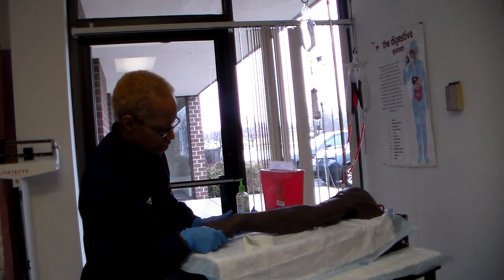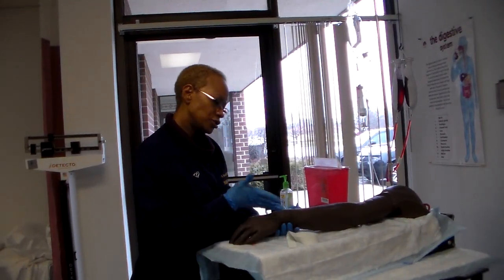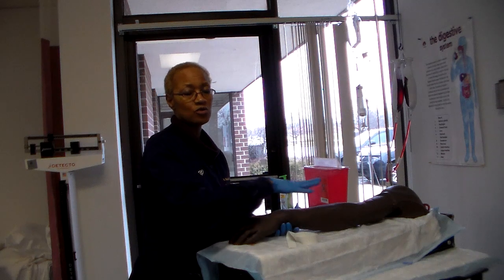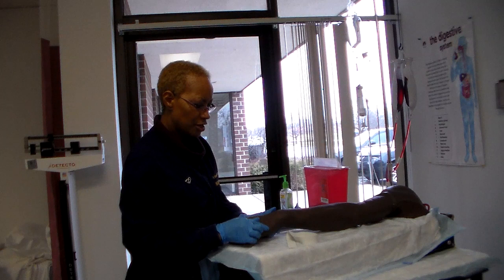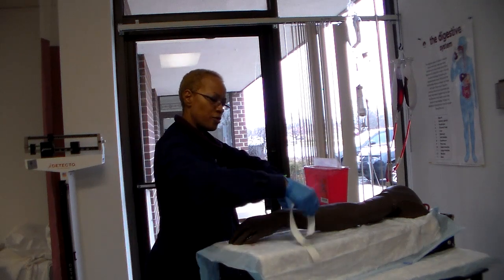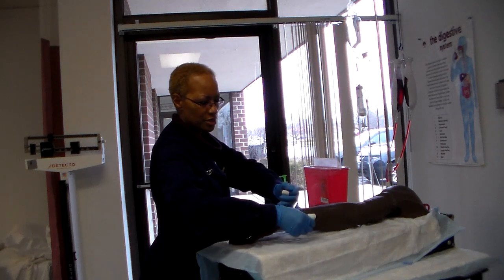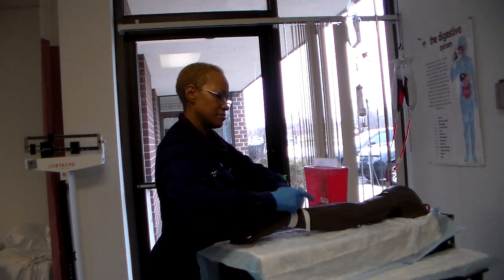So I'm going to look at the veins that my client has, and you want to start more distally. So we're going to start distal and work up. Hopefully you'll get in first time and you won't have to worry about his forearm or anything like that. But we're going to start in his hands, and we're going to look at the IV sites that we have. So about 4 to 6 inches above the site. So I'm going to start here. You're going to apply your tourniquet.